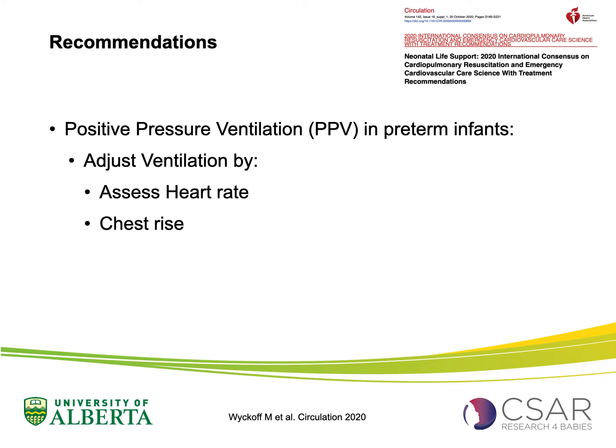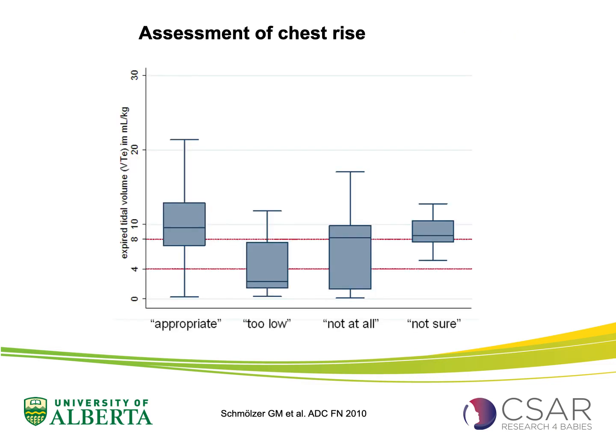One of the reasons is that, particularly now with having infants in plastic bags, it might be even more challenging to see if the chest is moving. But regardless, studies I've done myself as well as other people have shown that operators, when they stand at the head of the table and perform mask ventilation while assessing chest rise, struggle to do so. In fact, as you can see here, regardless of the volume delivered, they were really struggling to assess how much the chest is moving.